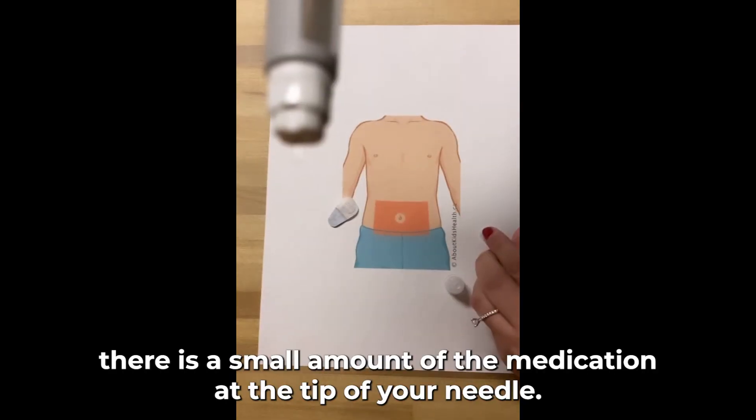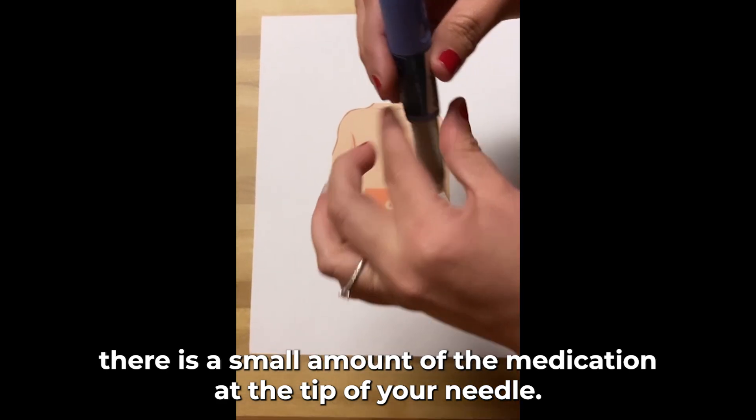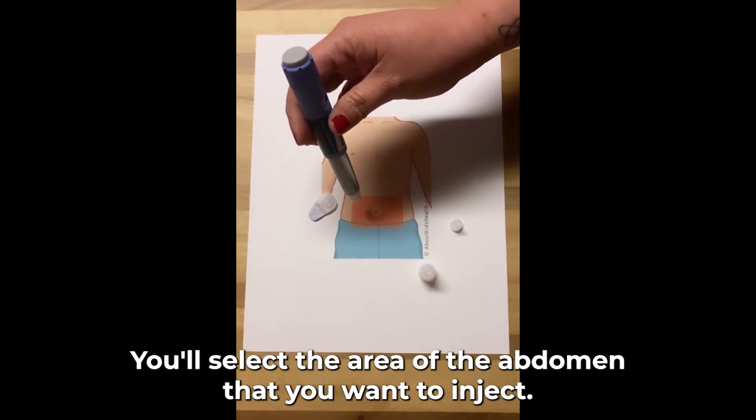You will see that there is a small amount of the medication at the tip of your needle. You'll select the area of the abdomen that you want to inject.